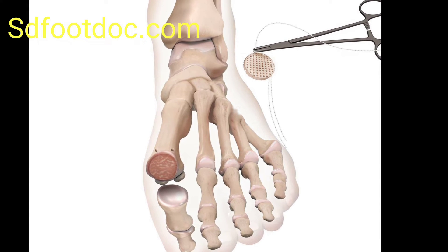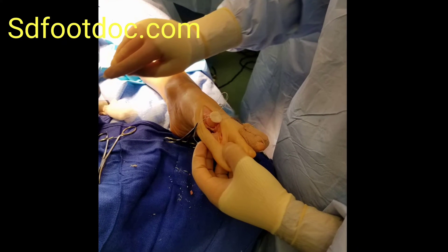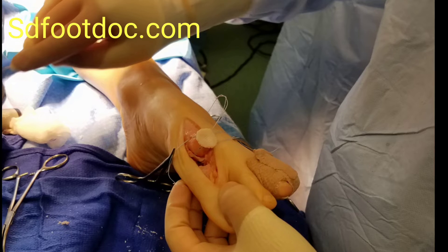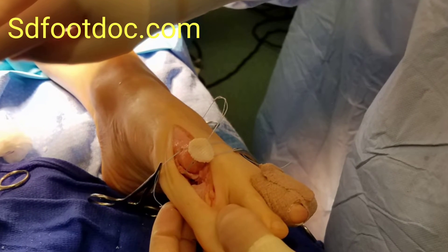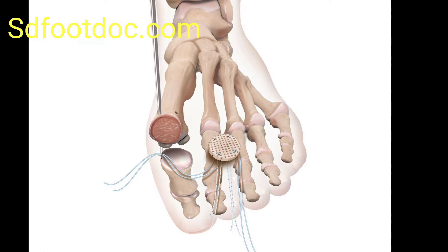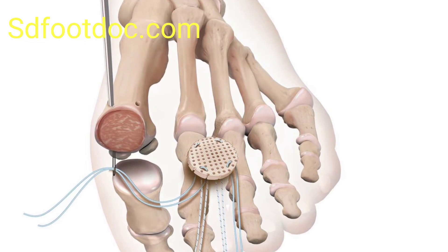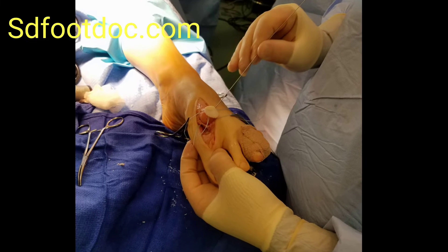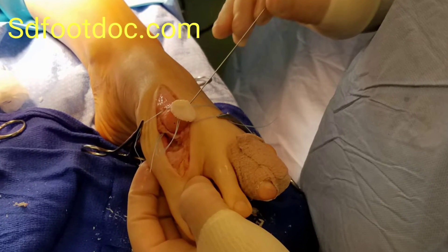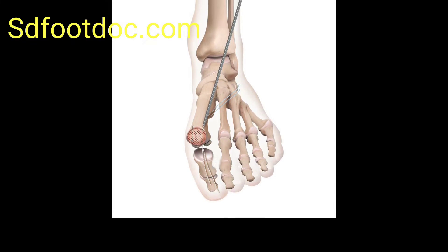It's an active biological matrix that treats focal osteochondral defects and promotes articular cartilage repair. Here we see the cartilage being attached to the bone. We have small drill holes that we pass sutures through, from the top to the bottom of the bone, to suture the cartilage down onto the bone until it takes. Sometimes we'll put on a small mini external fixator for a few weeks to hold it out to length so that the cartilage doesn't shift while it's getting absorbed and taken in.